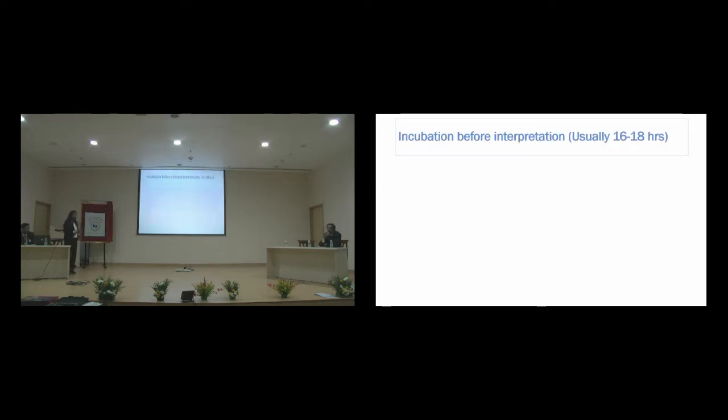Can I make a comment here? Two things I'd like to say. Number one, in susceptibility testing, the only thing that matters to us is growth or no growth. Any other phenotypic expression of the organism is to be ignored, whether it is hemolysis or swarming. All these things are of no value to us. Growth, and nothing but growth, is what is important for us.